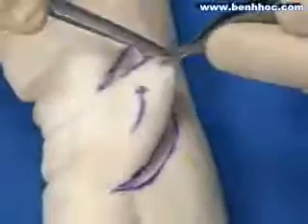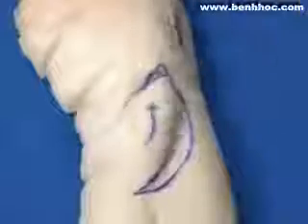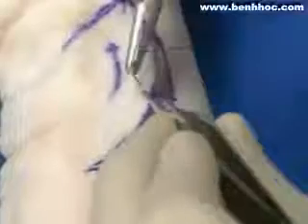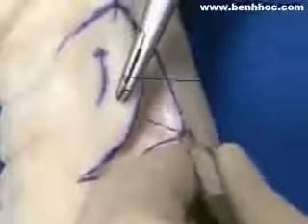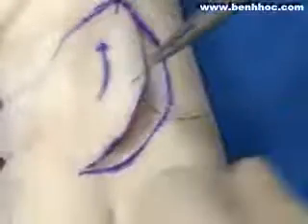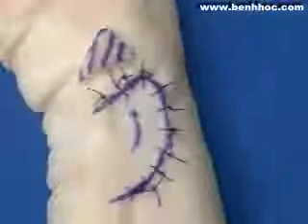The key suture is then placed. An instrument tie can be used with this flap design because there is not a significant degree of tension. The flap edge is then closed to the longer skin edge using the principles of halving, splitting each side in half for subsequent suture placement.